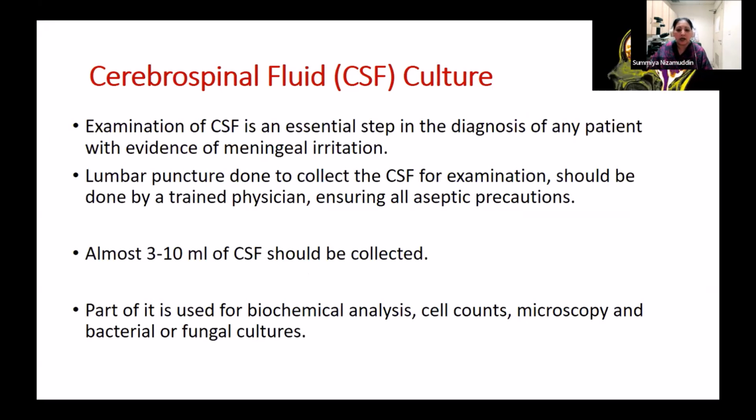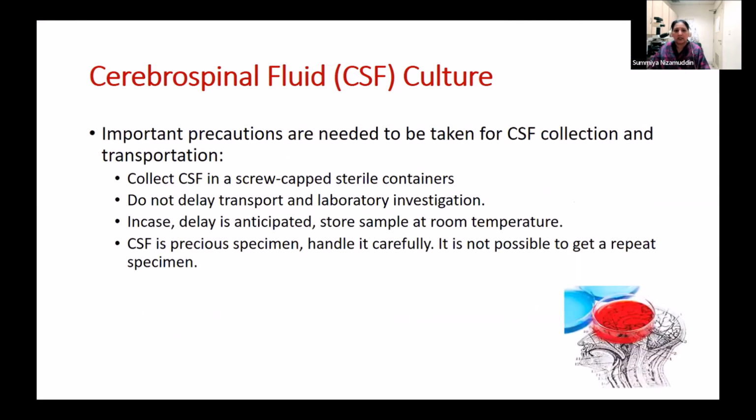Almost 3 to 10 ml of CSF should be collected, and when CSF is sent off to the lab, part of it is used for biochemical analysis, जिसमें वो glucose protein बताएंगे आपको. Cell counts के लिए sample भेजा जाता है, microscopy के लिए sample भेजा जाता है, and of course if you're suspecting a bacterial or fungal infection, cultures के लिए भी अलग से sample भेजा जाता है. So you have to ensure that an adequate amount of sample is sent so that ये सारे tests हम पूरे कर सकें.